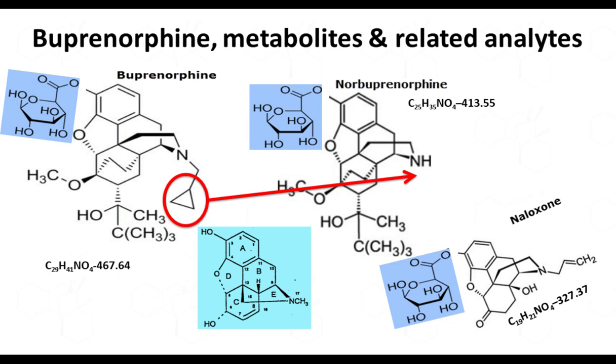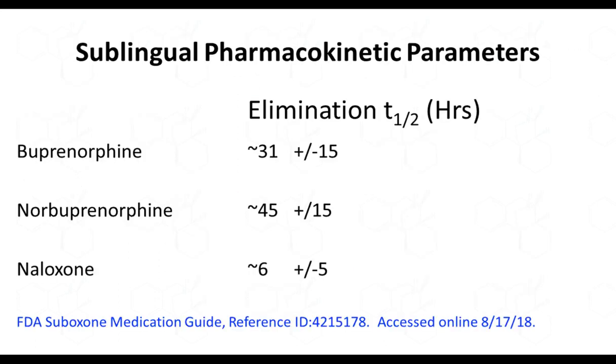And that's of interest both in terms of how the drug is handled in the body as well as what we do with it analytically in a urine sample.